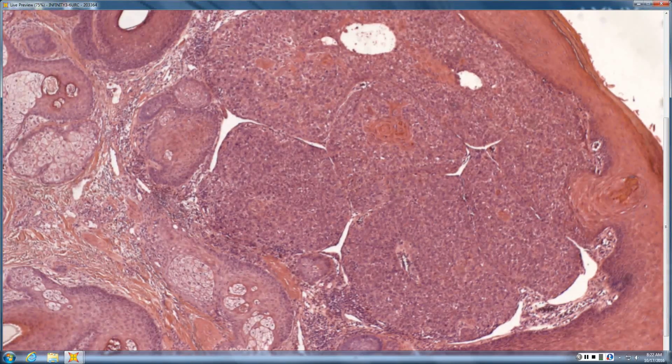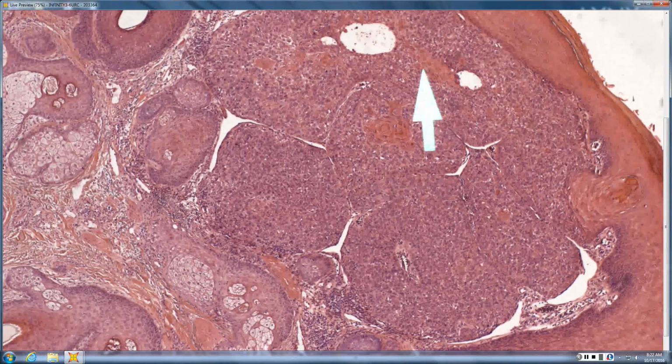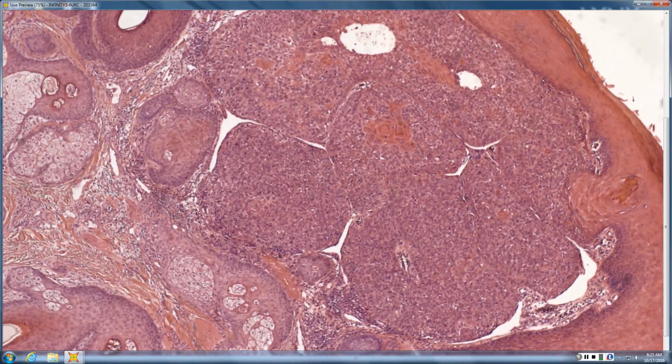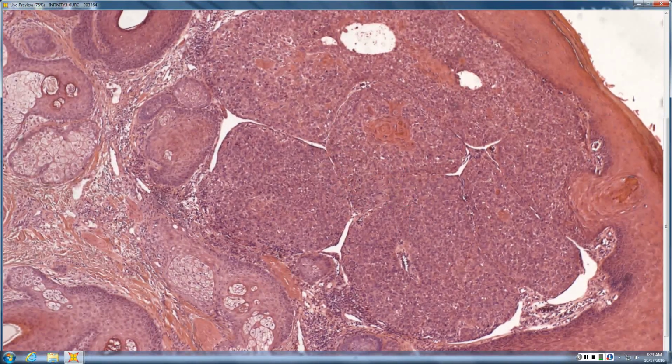This looks like a neoplastic lesion coming off the epidermis. Okay, and what kind of neoplastic? So it looks like a squamous. It's forming keratins, so it's squamous, and so that's absolutely so. How well differentiated? Since it's making the squamous eddies and it's like encapsulating itself, I would say it's well differentiated. So this one I probably put in the moderate. So poorly differentiated doesn't keratinize at all. That would be anaplastic or spindle. Well differentiated is pretty glassy, looks like surface epidermis. This one, they're large hyperchromatic cells, and focally they're still making keratin. That puts you in moderate.